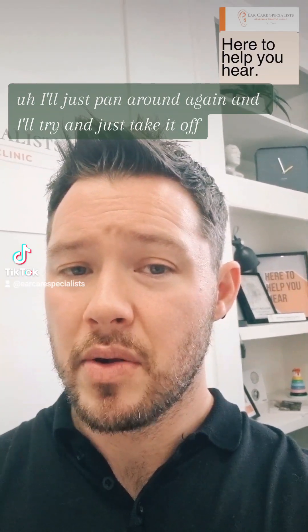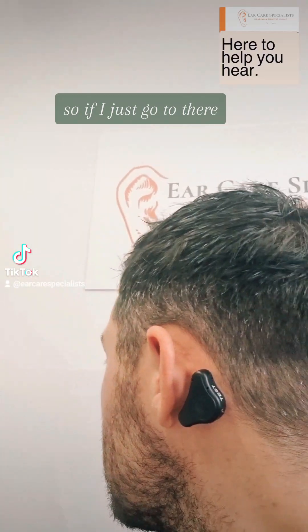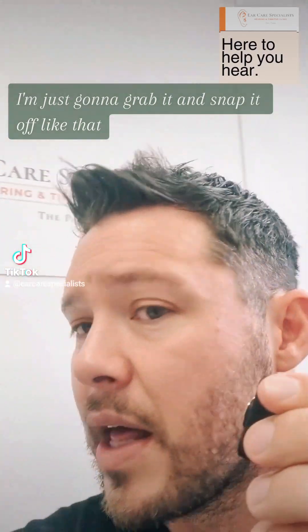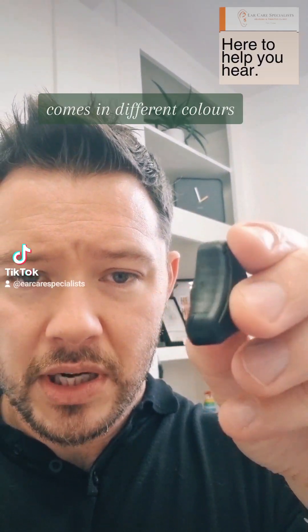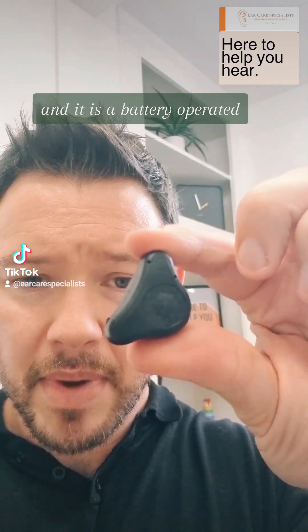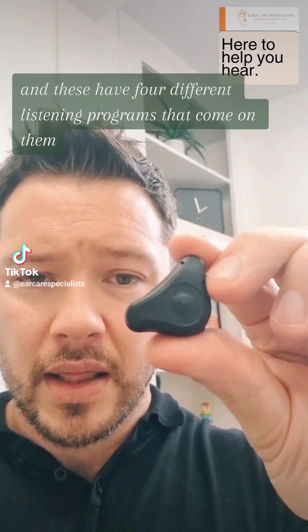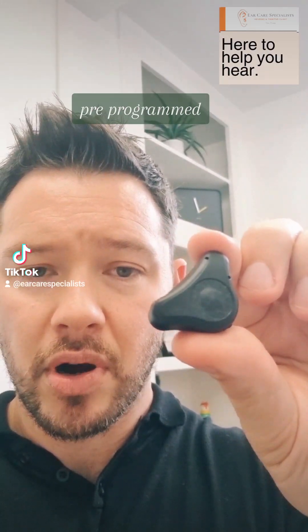I'll just pan around again and take it off so you can see how it comes on and off. I'm just going to grab it and snap it off like that. You can see the device here — it's pretty small, comes in different colours, and it is battery operated. A single battery will last about two weeks, and these have four different listening programs that come pre-programmed.